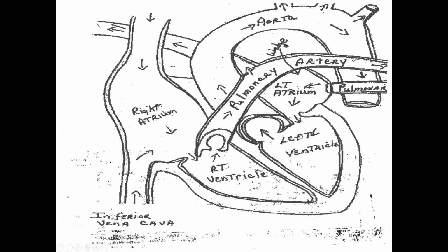Some hospitals put in, and this was years ago, I don't even know if they do it anymore, left atrial lines, which I've never had. I've never taken care of anybody that's had a line in the left atrium. So really, the only thing that you would think of where the catheter would be is down through the right atrium, right ventricle, and then it just kind of floats around in the pulmonary artery, okay? That's the pulmonary artery catheter, also known as a Swan-Ganz, which is named after the two physicians who developed that catheter.